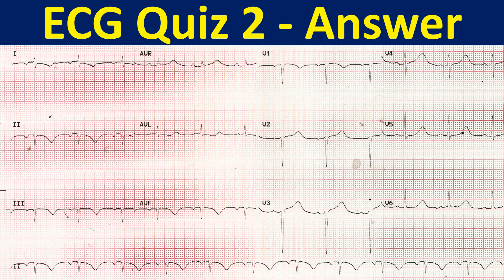When the left leg electrode is placed on the right arm and vice versa, the P wave, QRS, and T waves — which usually have downward vectors — get inverted. So this is a right arm-left leg lead reversal.